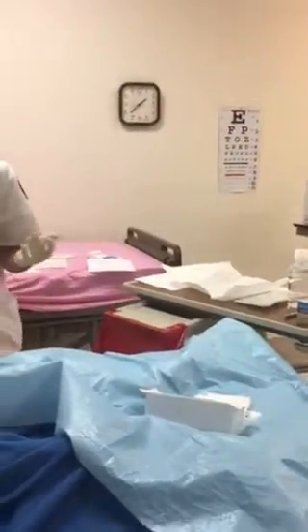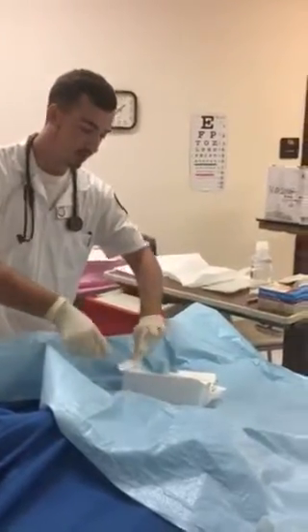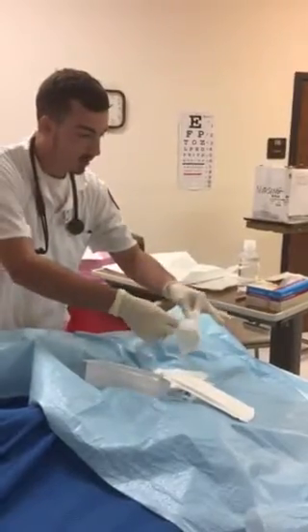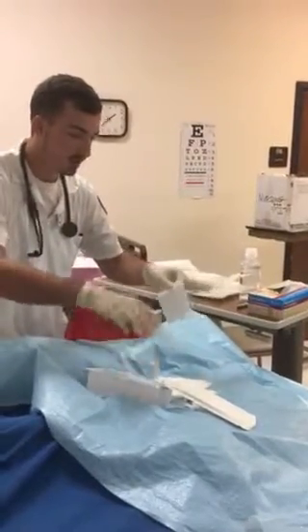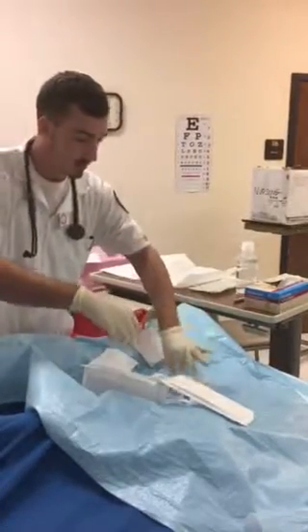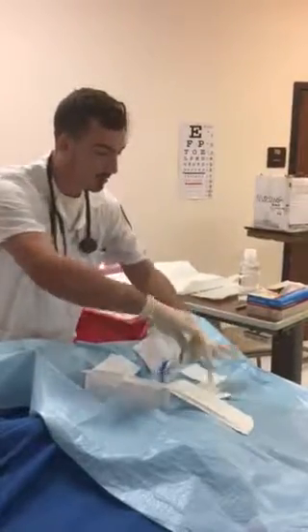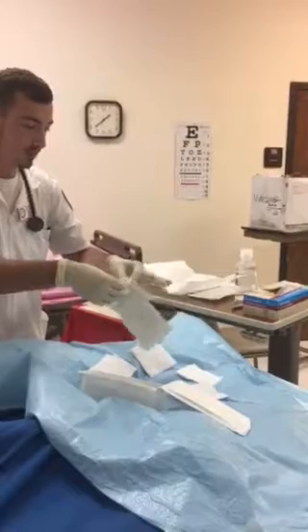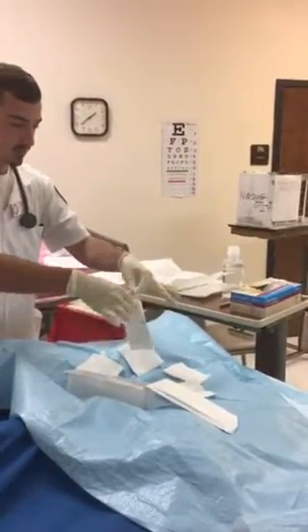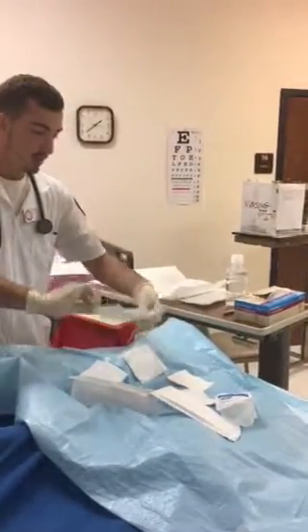And now I'm ready to apply the new dressing. So I can go ahead now that I have my sterile gloves on and open up all of my supplies onto my sterile field. I'm going to go ahead and place some gauze in my basin for my sterile saline to saturate. I'm going to get my dry gauzes ready to dry and replace, and open up my pad that I'll need to complete the dressing change. Get it spread out just like that.